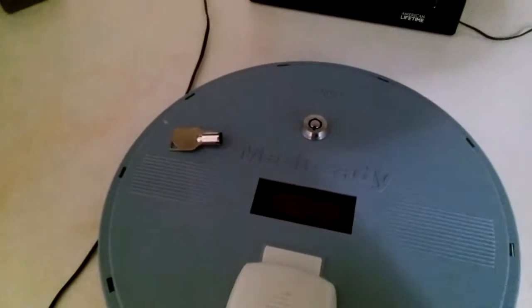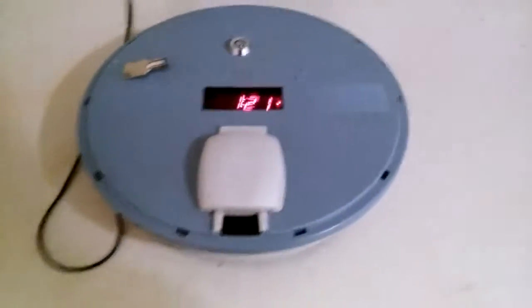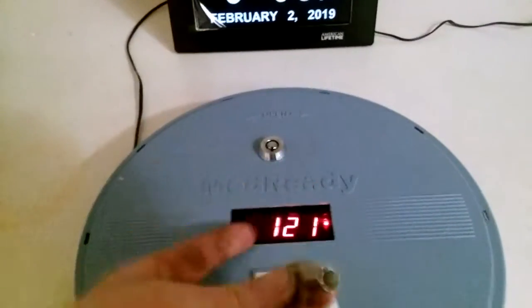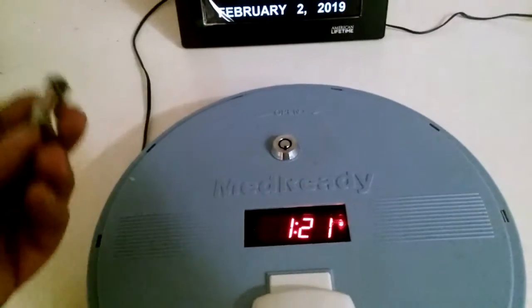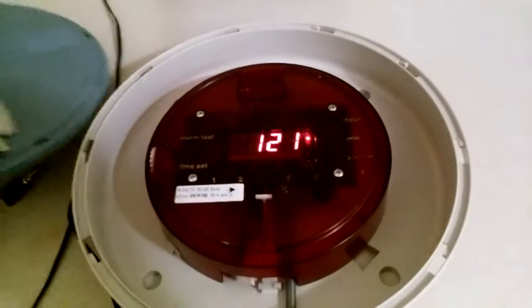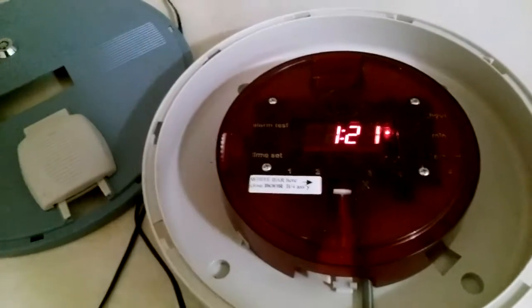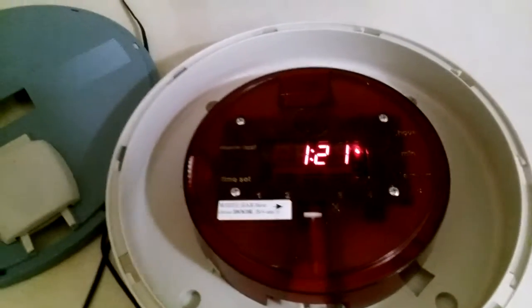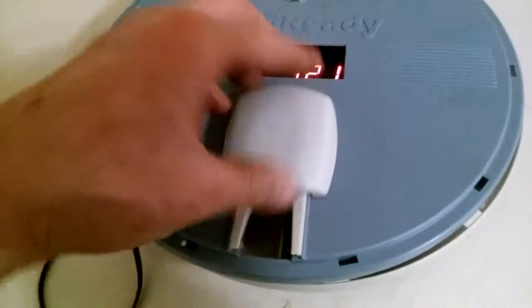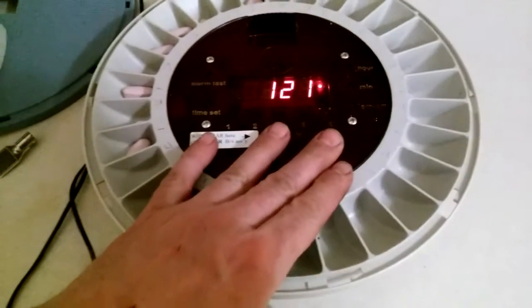Even with the power off it still keeps the time. This battery hasn't been plugged in for a long time. You can get a lock so they can't get into it as easily - the lock is like two or three bucks from them. If they need to work on it, you can get gears for them really cheap, like two or three dollars for the gears. The gears get stuck because the person sticks their hand in there and just advances it manually, so after enough times it can get ruined.